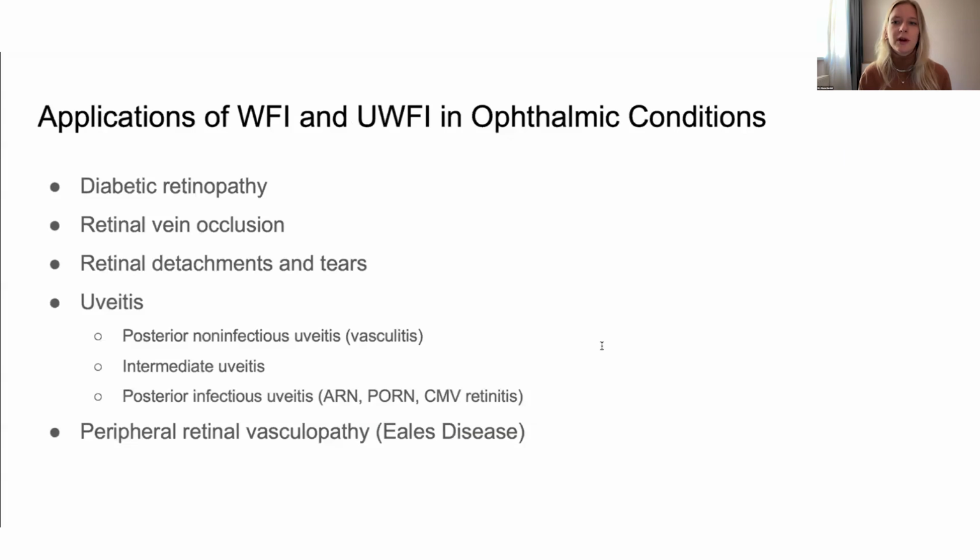And which patients will benefit from using these widefield imaging techniques? Vascular changes, such as we see in diabetic retinopathy, as well as retinal occlusive diseases and different retinal vasculopathies, will be much more visible on widefield images compared to the conventional images that we can make with the fundus photo.